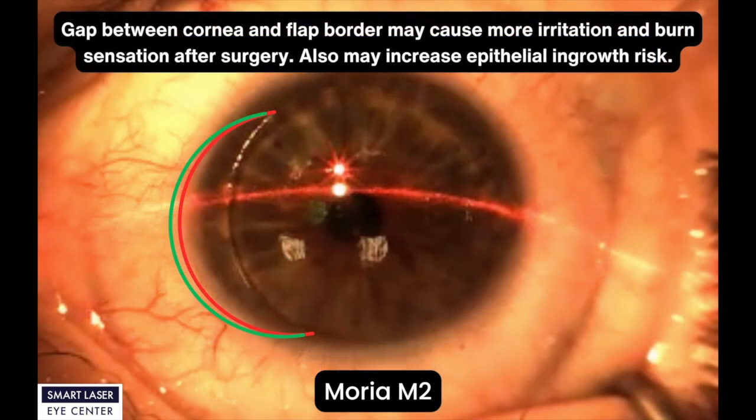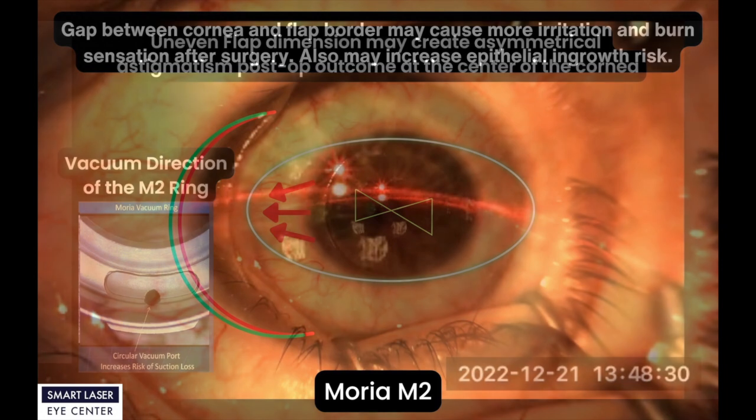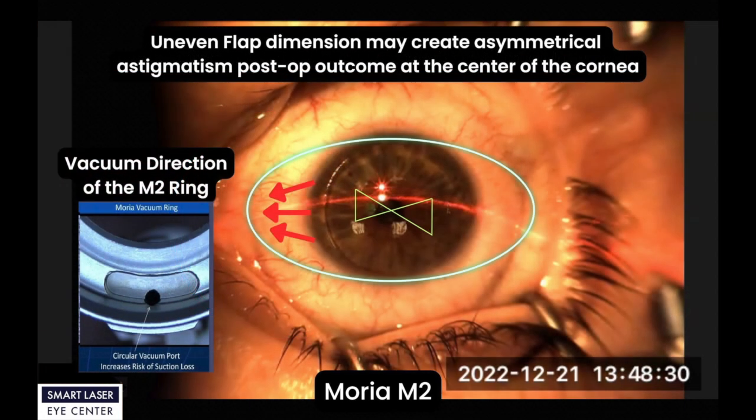In this Moria M2 final surgery video capture, you can easily see the gap between cornea and flap border. This may cause more irritation and burn sensation after surgery, and may also increase epithelial ingrowth risk. Additionally, uneven flap dimension may create asymmetrical astigmatism post-op outcome at the center of the cornea.